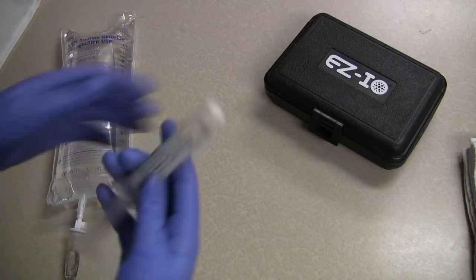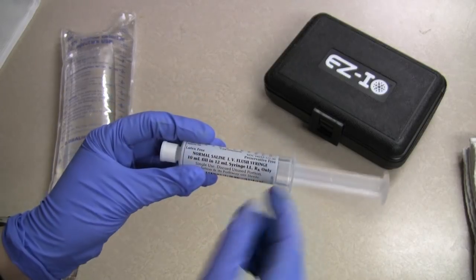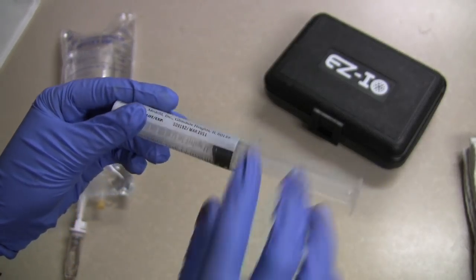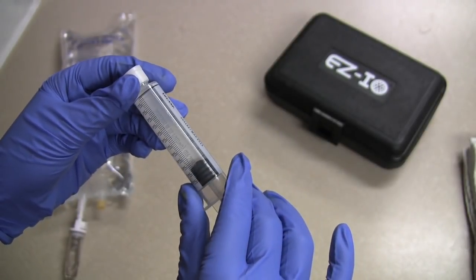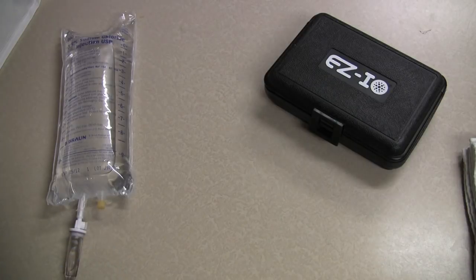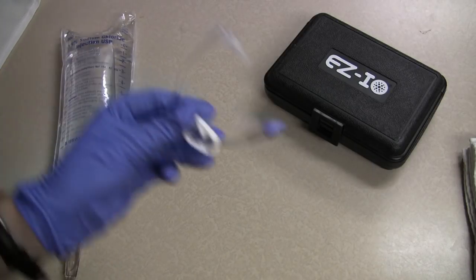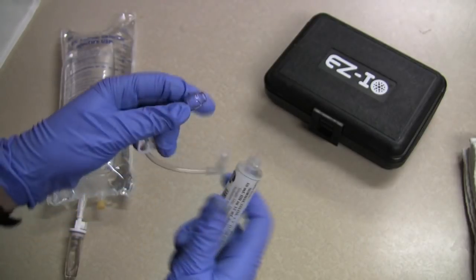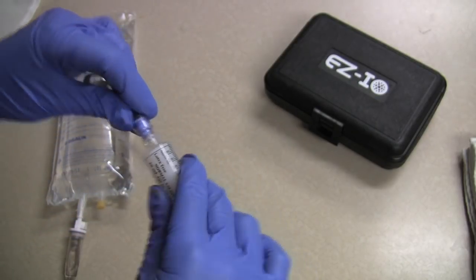I'll take out my extension set and my flush, checking that it's normal saline and that the expiration date is good. It's 10 milliliters and the fluid looks good. I'm going to take my special extension set made for the IO and flush the line.